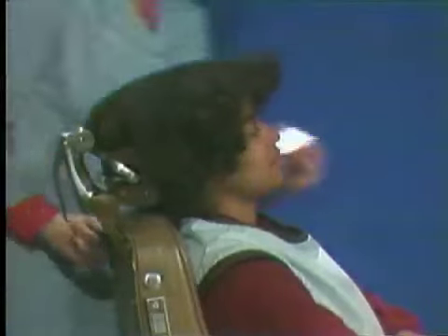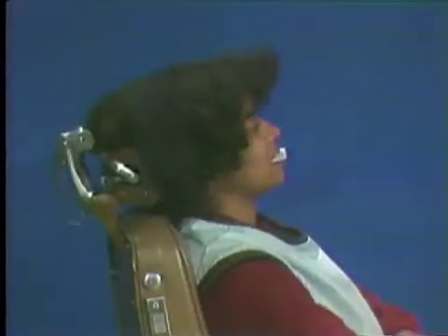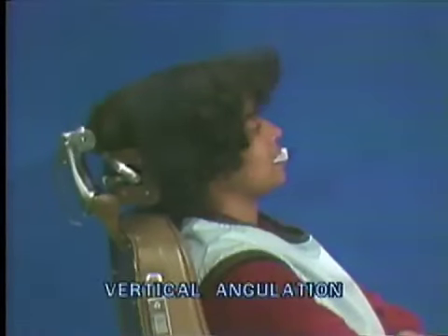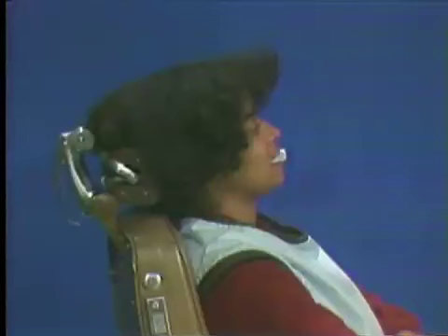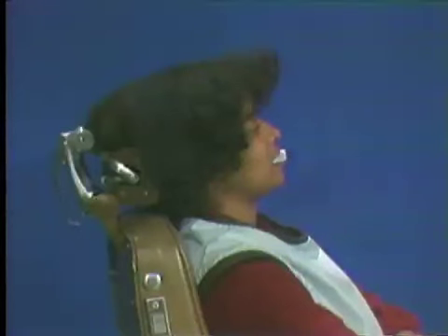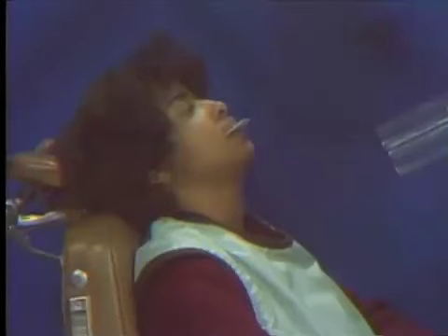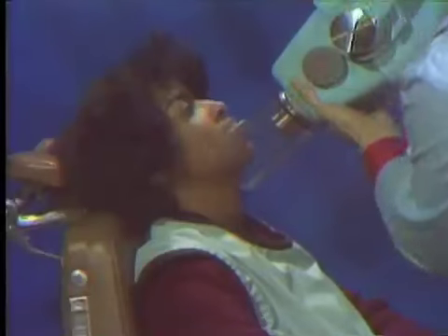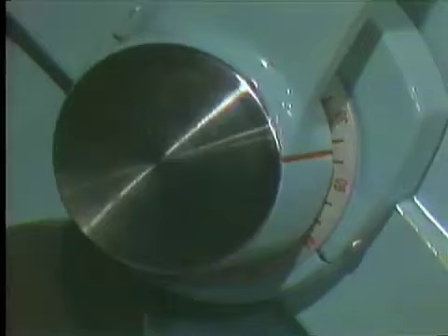For this radiograph, the film is placed on the occlusal surface of the teeth with the long dimension anterior-posteriorly. The sensitive side faces the mandible. The vertical angulation will be set at an angle of 60 degrees to the plane of the film, like the maxillary occlusal views. However, if the patient's occlusal plane is kept parallel to the floor, there will not be enough room to place the x-ray machine in the correct position. To avoid this problem, the patient is asked to tip the head back a comfortable distance. The top edge of the x-ray cone is lined up parallel to the plane of the film, and the vertical angulation is noted on the vertical angulation scale. The vertical angulation is then increased by 60 degrees in an upward direction. Note that the exact angle depends on the amount of backward tilt of the patient's head.